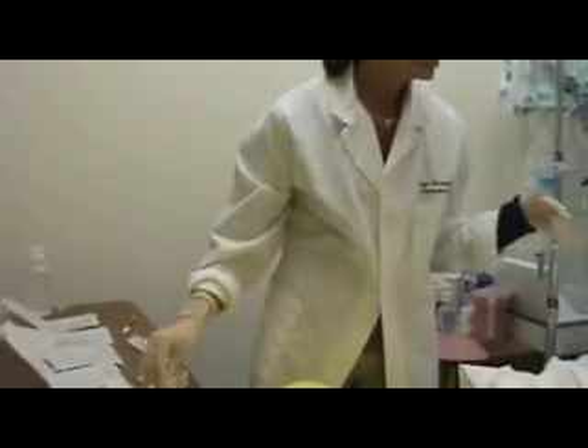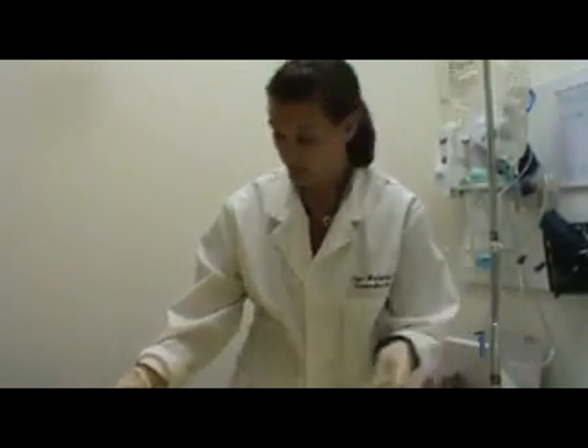We're done! Well, we're not really done. Now we have to cover the patient, put the cover back up. I would again assess: how are you feeling, did you have any discomfort during the procedure? Then I am going to go and document — and again you can refer to the skin integrity PowerPoint slides that we did in lab. I hope you enjoyed this video and find it useful, thank you!